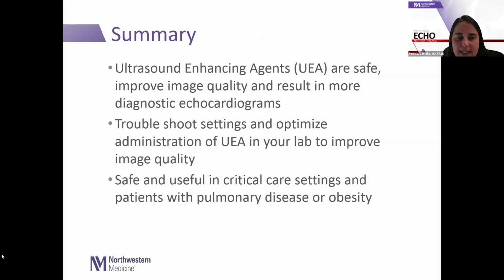Finally, ultrasound enhancing agents are safe, they improve image quality, and result in more diagnostic echocardiograms. It's important to troubleshoot settings and optimize administration of UEAs in your lab to improve image quality. And finally, ultrasound enhancing agents are really important in the critical care setting and in patients with pulmonary disease and obesity.